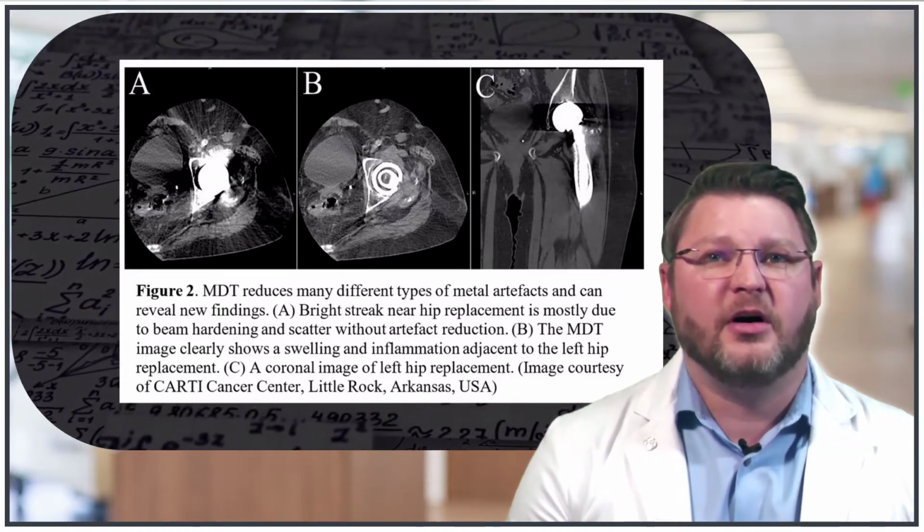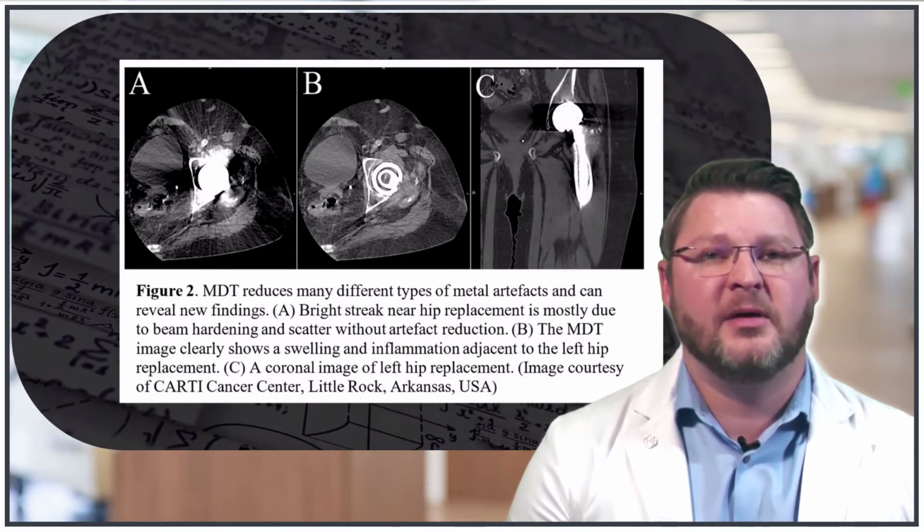These artifacts are caused by dense metallic objects being inside the scan field of view. We can prevent this by removing all the metallic objects from the scan field of view if possible. Technical novelties that may be used is metal artifact reduction software. In my opinion, most of these do a great job and improve image quality. Next are motion artifacts seen on CT. There's another extremely common artifact you can come across.